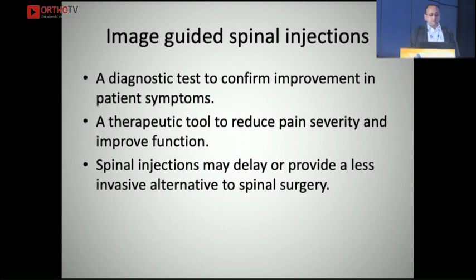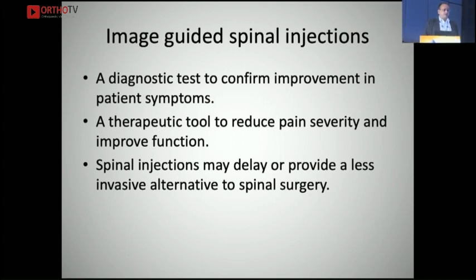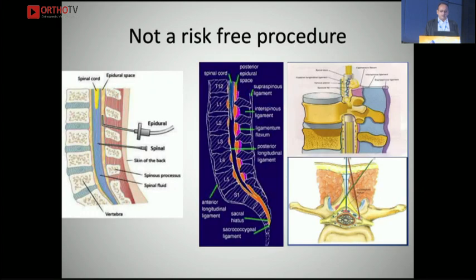Image-guided blocks are a diagnostic tool to confirm improvement in patient symptoms and a therapeutic tool to reduce pain severity. These can also be used to delay surgery when the patient is unfit, for optimization purposes.